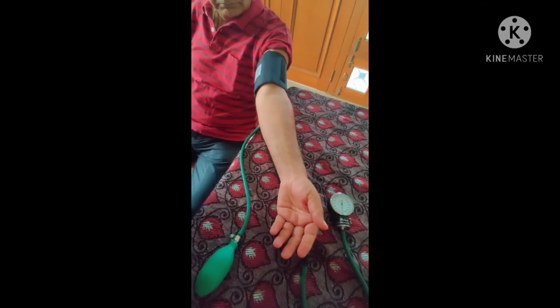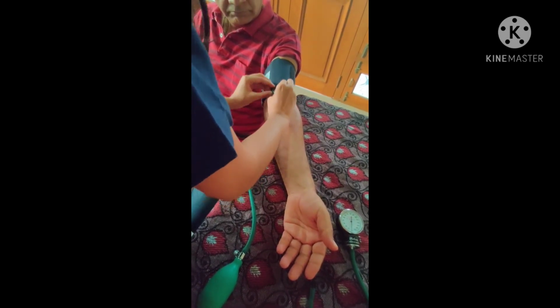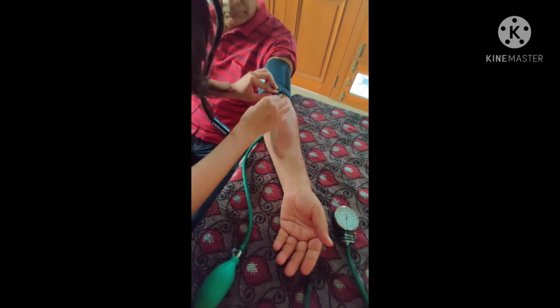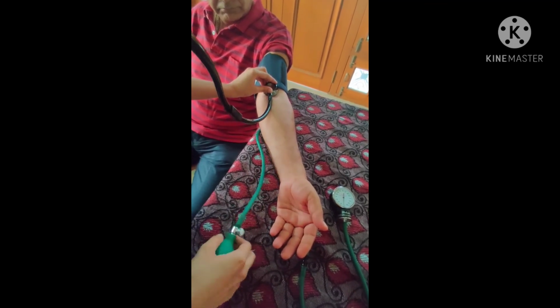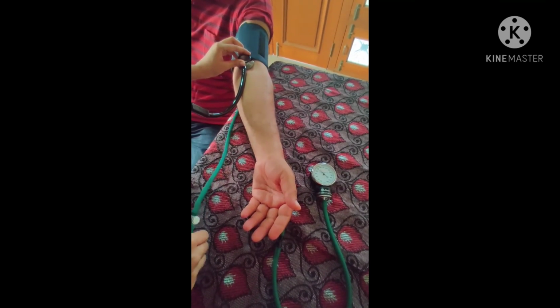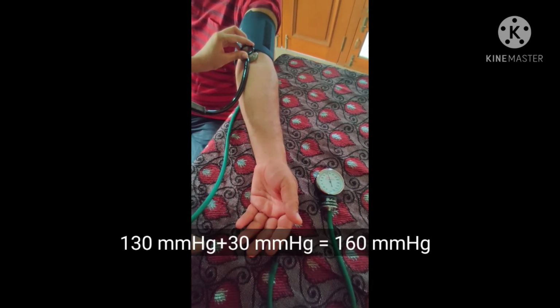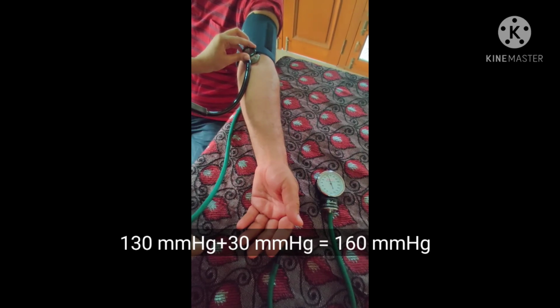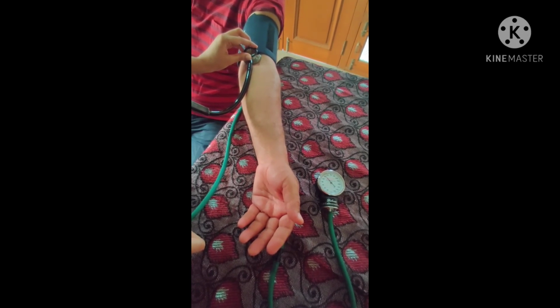Place the stethoscope lightly over the brachial artery, taking care to make an air seal with the full rim. Also, tighten the valve of the bulb. Inflate the cuff rapidly to the determined level. Here it is 160 mm of Hg. Then deflate the cuff slowly at the rate of about 2 to 3 mm of Hg per beat.